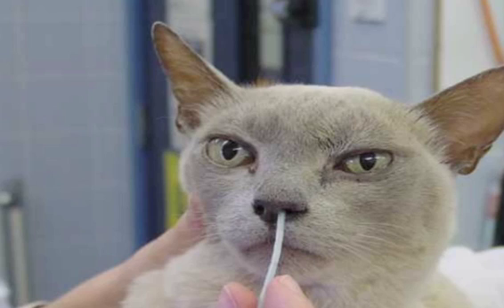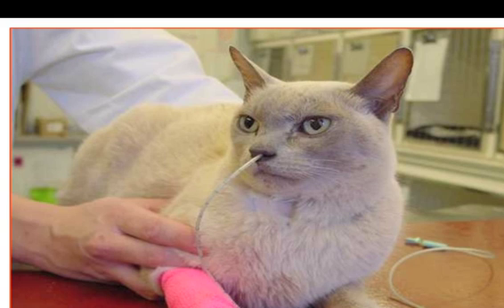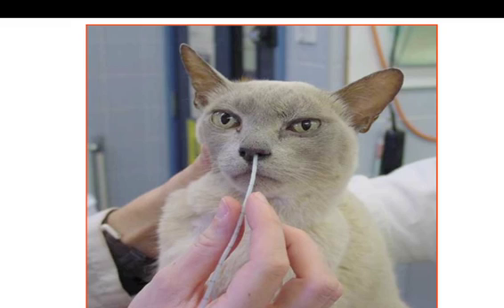Now, clearly, the problem with placing these is putting them into the lungs, or — particularly in dogs — it's more of an issue of meeting a dead end within the turbinates of the nose. If you're having that problem, it's usually a problem of not aiming ventromedially enough. My advice would be to hold the tube like a dart and just dart it into the nose. The sensitive bit is going to be the turbinates and the initial entry. So just fire it in, and then don't mess about — get it threaded. Don't leave it in that initial bit of the nose because it will fall out. Try and fire it in and then start to thread it quite rapidly.